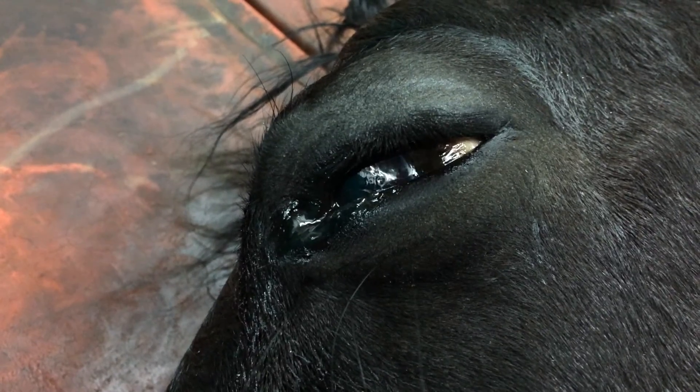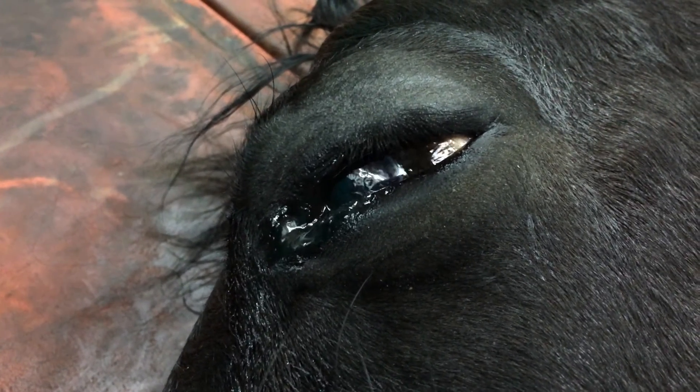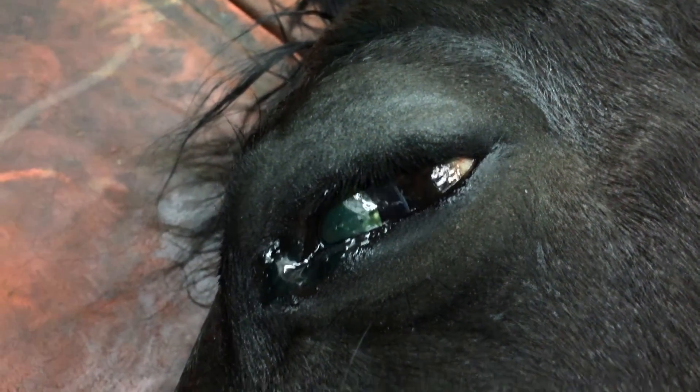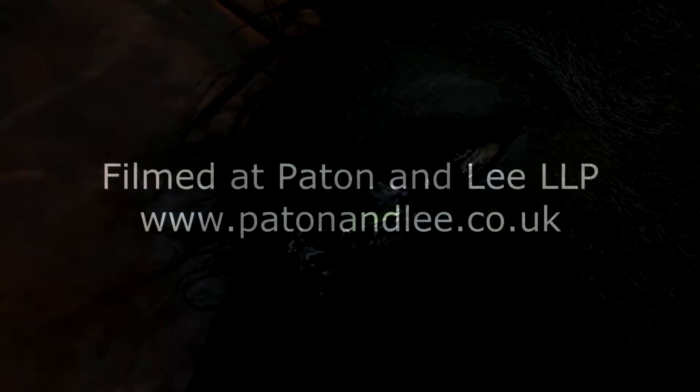Here the horse is now in recovery and you can see nystagmus. As the horse begins to get lighter and start to wake up, we have the pupil moving backwards and forwards with nystagmus. Thank you.